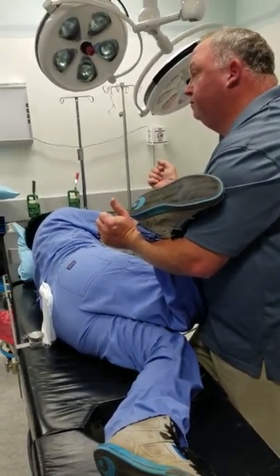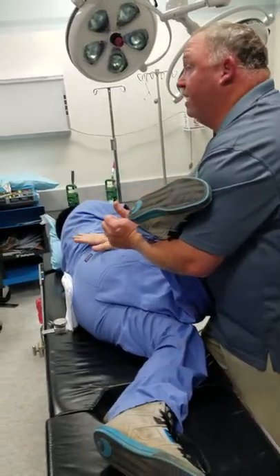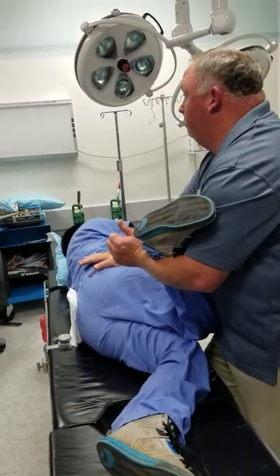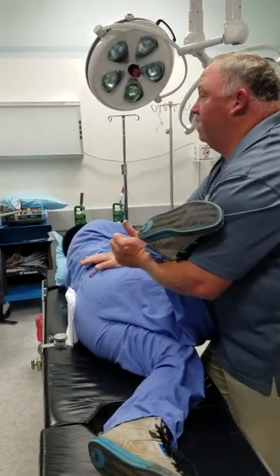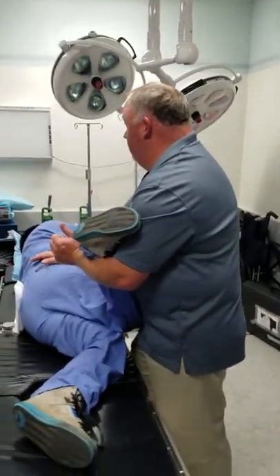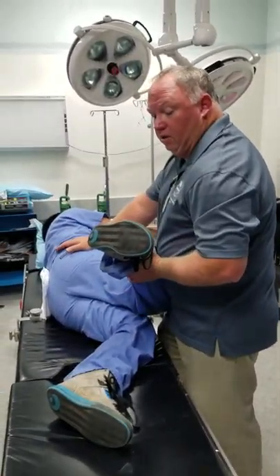So the first part — the anterior approach — was for the supine hip, and this is the posterior hip. So that covers the full hip — anterior approach and this, the posterior approach.